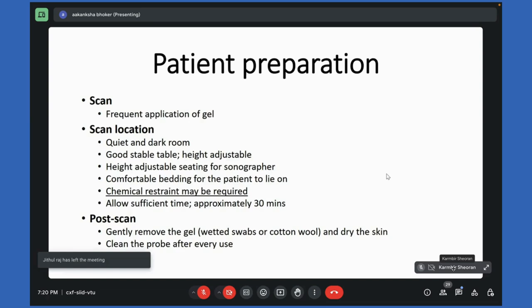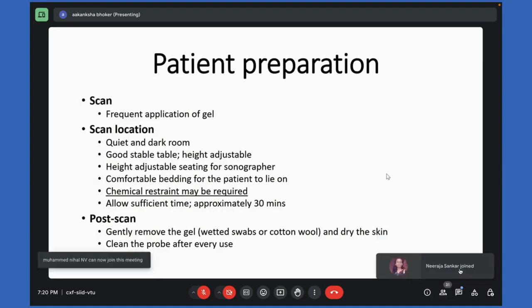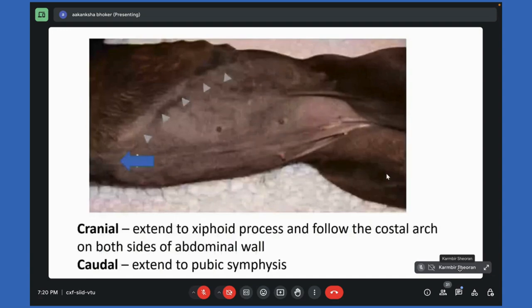For performing any sonographic examination, we should do a thorough examination. We should at least spend around 30 minutes. Maybe with time we can do the examination very quickly, but we should perform an in depth examination wherein we evaluate each and every structure. Post scanning, we should remove the gel from the animal and from the probe also, because we need to maintain the probe so that the quality of the ultrasound waves generated from the probe does not get deteriorated over time.